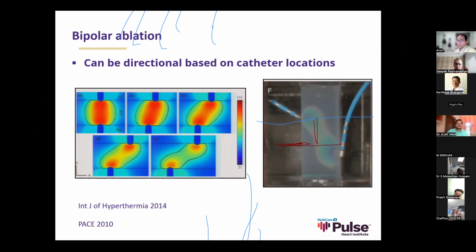Now the issue is that you can have some variations in the case too. I don't have a graph like that, but there are some graphs you can see in publications where the impedance actually varies with every respiration, and it is very pronounced in some people compared to other people, because as soon as the lung fills up with air, the impedance in the system goes up. So there is actually a respiratory variation, a wave-like variation with the respirations.